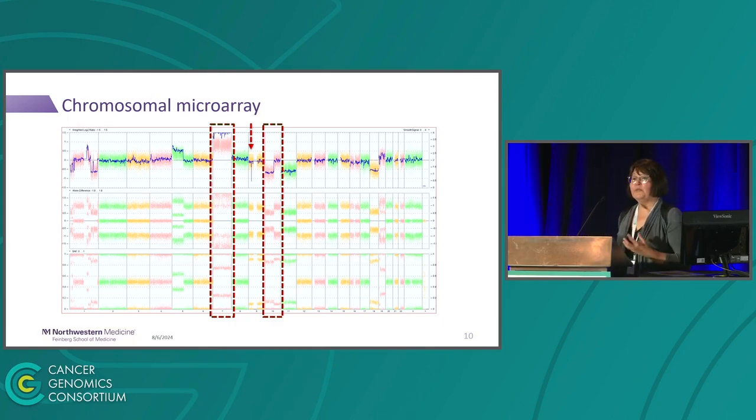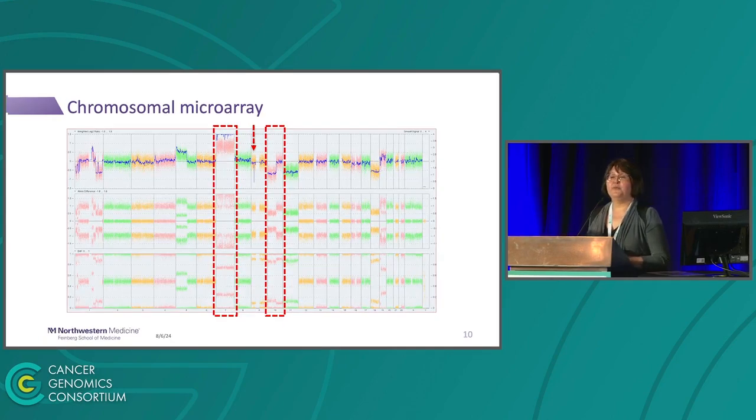And the reason for that was this very weird glial immunostaining, and also the fact that the patient is a female, very obese, and a former smoker. So as you can see from this whole genome view plot, there is gain of 7, and there is a segmental loss of 10p. And I should mention that we already validated version 3 of copy number assessment from methylation data.